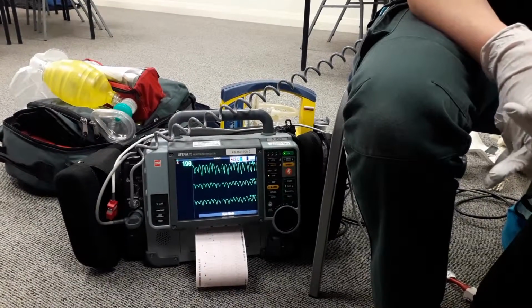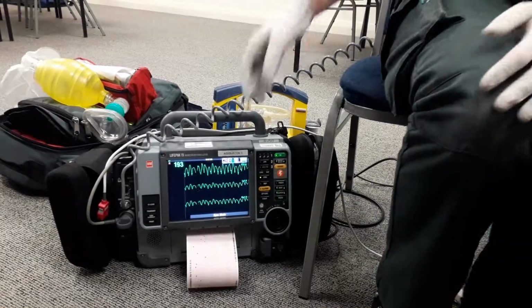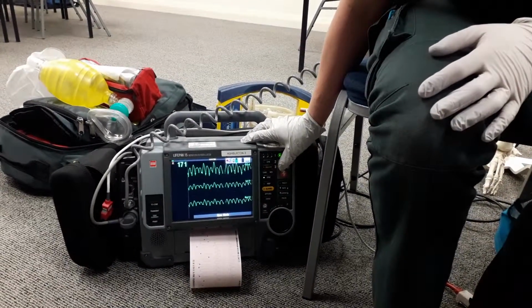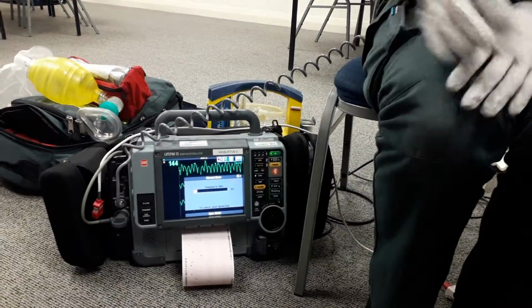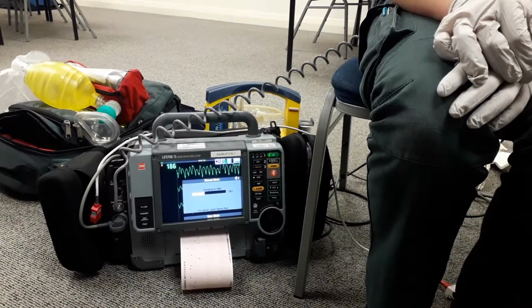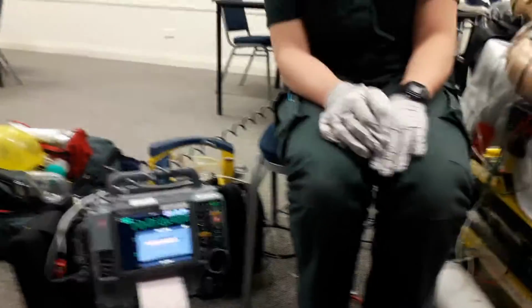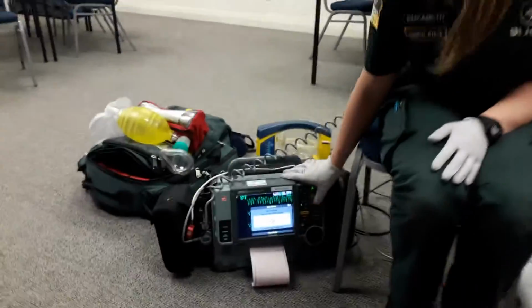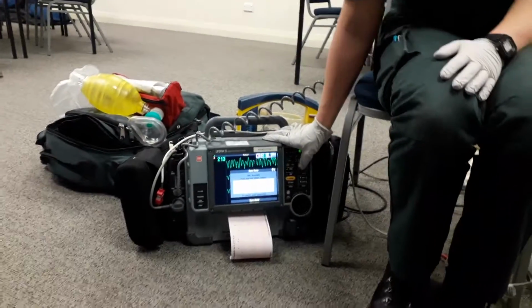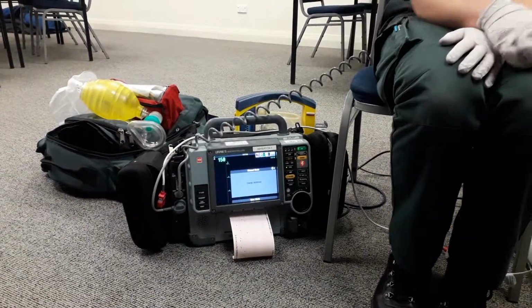Select the joules, charge the defibrillator and confirm everyone is clear. So I will charge the defibrillator at maximum joules, 360. That's charged. Checking everyone's clear. Press and hold the shock button until the shock is delivered. Okay, shocking now. Shock delivered.